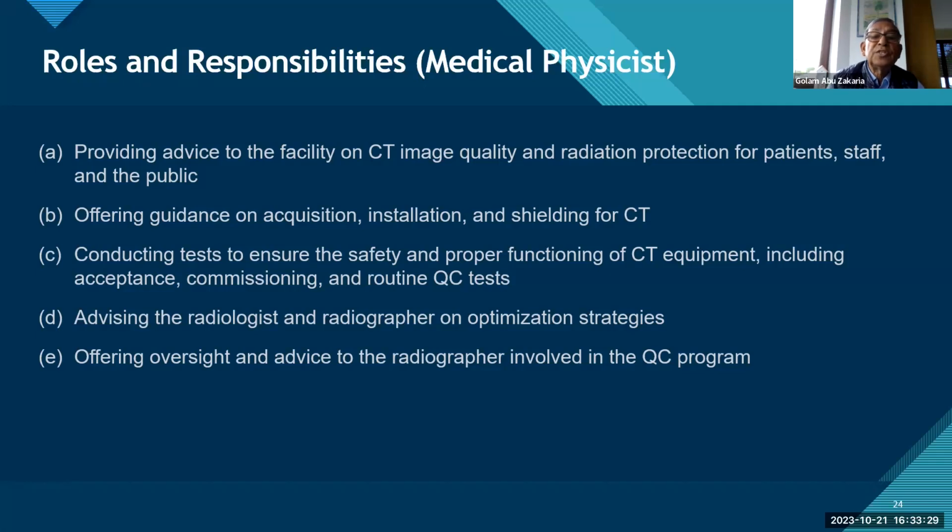Conducting tests to ensure the safety and proper functioning of CT equipment, including acceptance, commissioning, and of course then the routine QC tests. Advising the radiologist and radiographer on optimization strategy. I have talked many times that the medical physicist should teach the radiologist and radiographer the optimization process, how to lower dose with the proper quality of the image. Offering oversight and advice to the radiographer involved in the QC program.